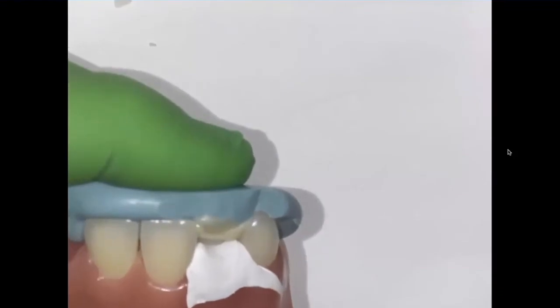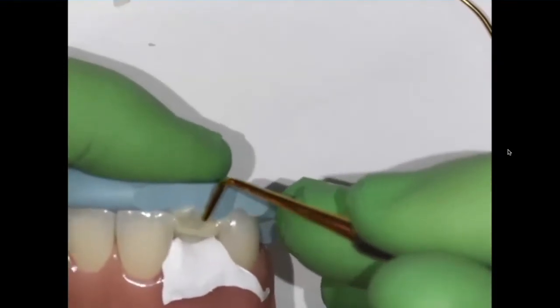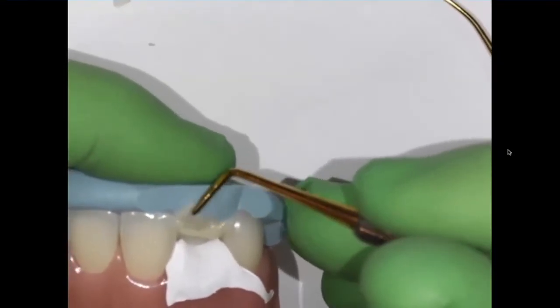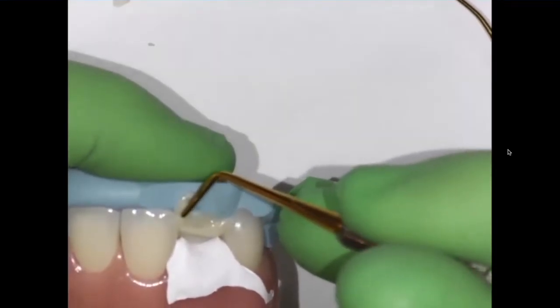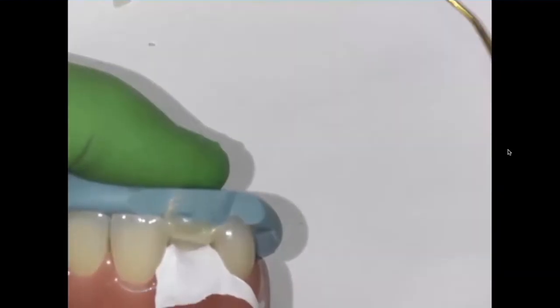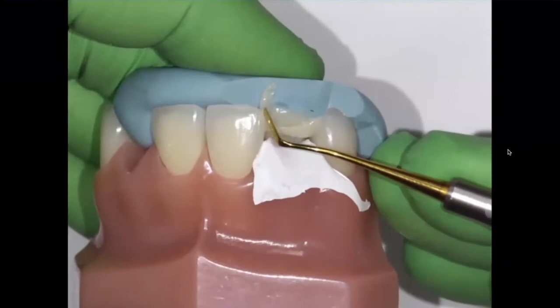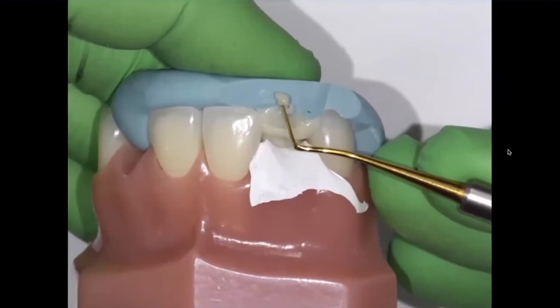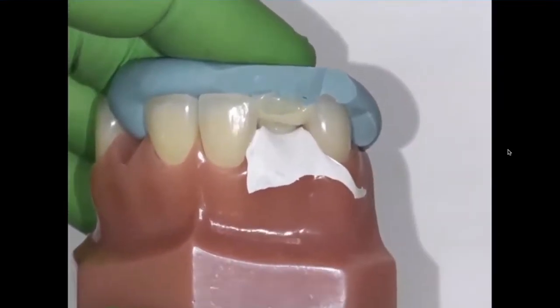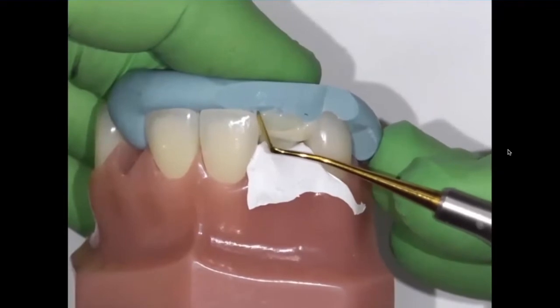Now what's important before I start light curing: I want to remove any excess material that I can. So I'm going to come in first with my multipurpose instrument, cleaving away on the incisal. Coming in with an IPC instrument — these IPC instruments from Cosmedent are awesome because they're so thin, like a tenth of a millimeter thick, and you can really get into interproximal and open up the embrasures.